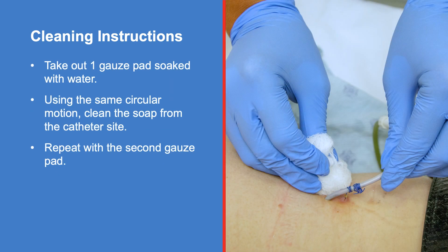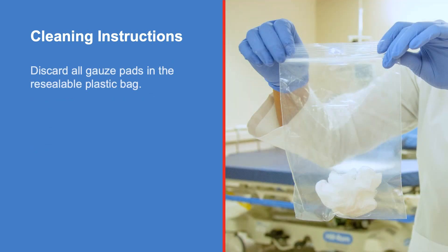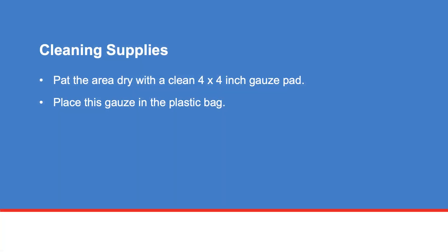Take out one gauze pad soaked with water. Using the same circular motion, clean the soap from the catheter site. Repeat with the second gauze pad. Discard all gauze pads in the resealable plastic bag. Pat the area dry with a clean 4x4 inch gauze pad and place this gauze in the plastic bag.